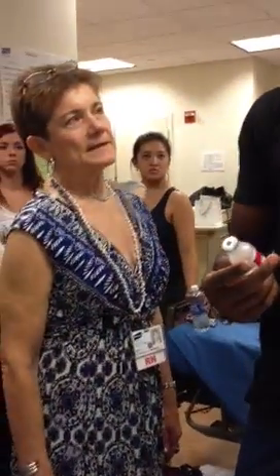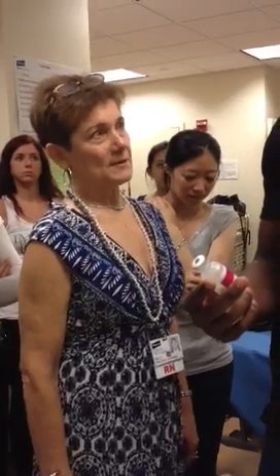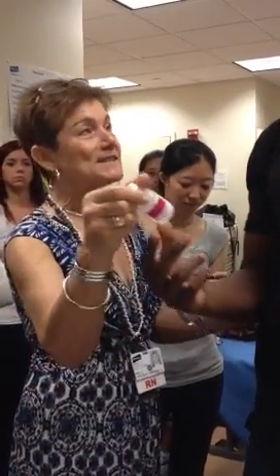And so you said 1 milliliter? Okay. So I'm going to read the drug and look at it and see what it says, and recheck that it's matching the order and it's correct. So what does this drug say? It's Depo-Provera, 150 milligrams in 1 ml. That's what you're going to end up giving, but you have to check here and see what it is.